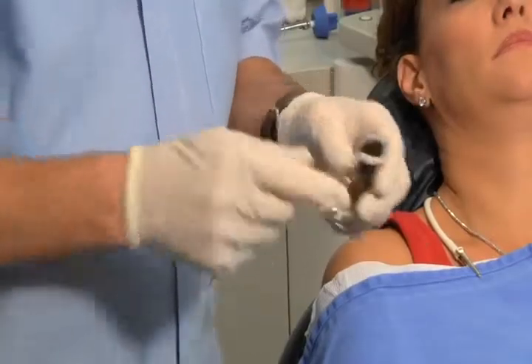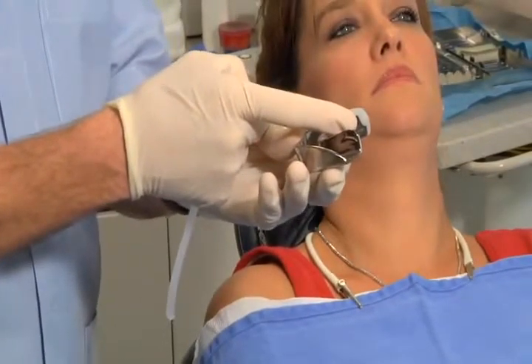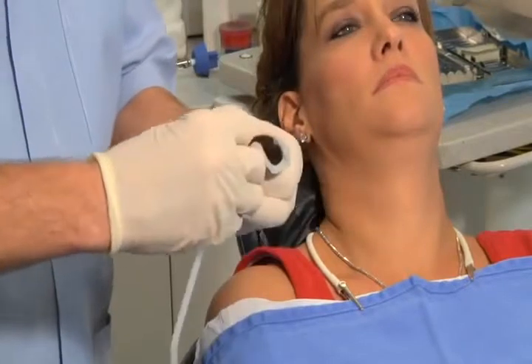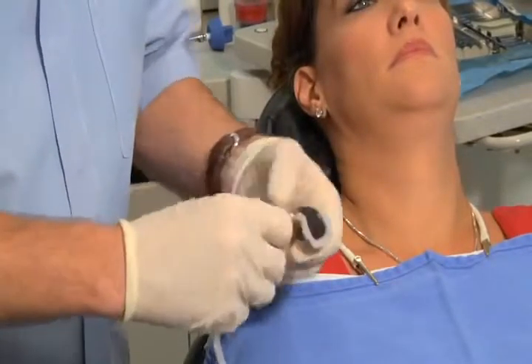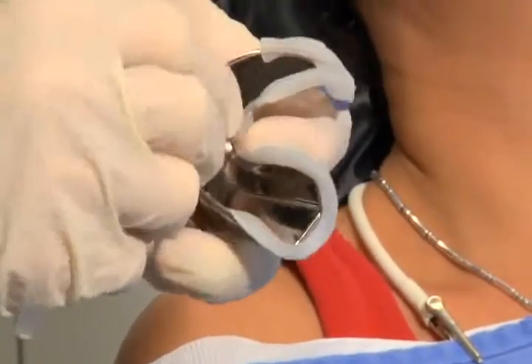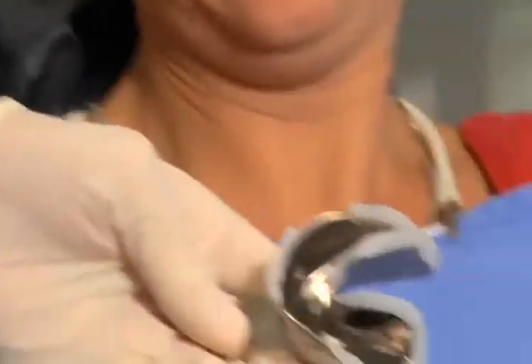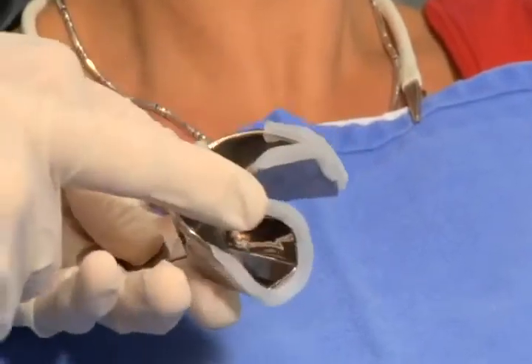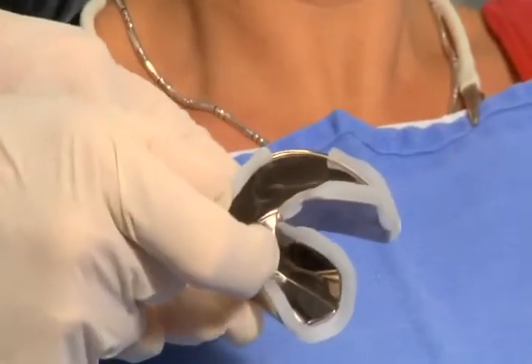The next thing to ensure accuracy is applying wax to the tray. On the lower, I put wax on the back extent of the impression tray, a little bit under the tongue, and a little out onto the buccal shelf. That way if I run into the retromolar pad, I can carry alginate down into the floor of the mouth. I'll do the same on the other side and put a little piece in the front — that's how we do it for everybody.